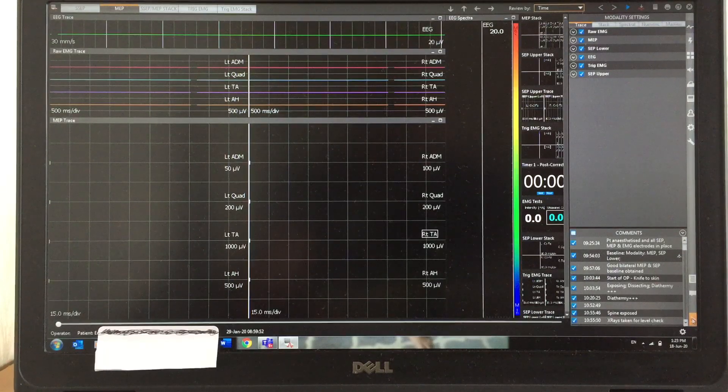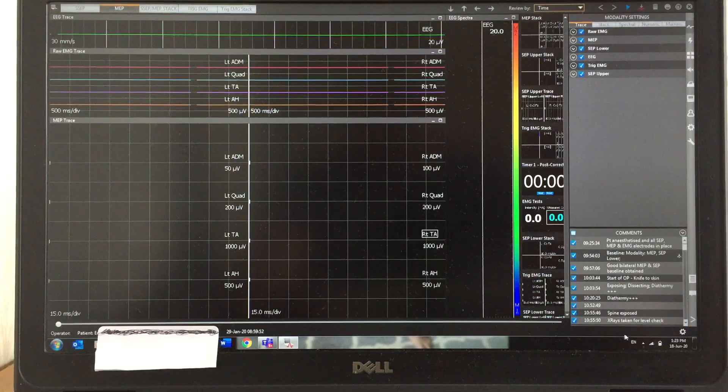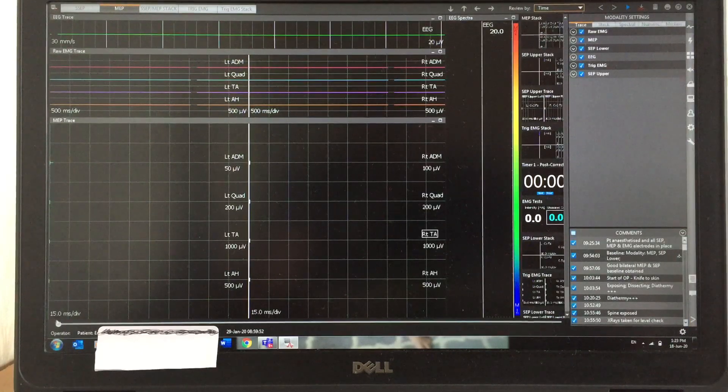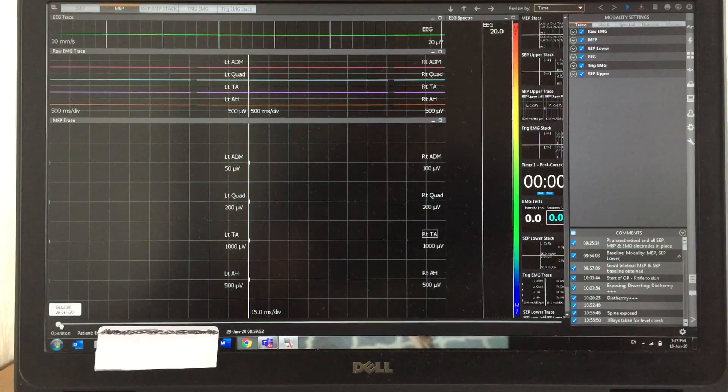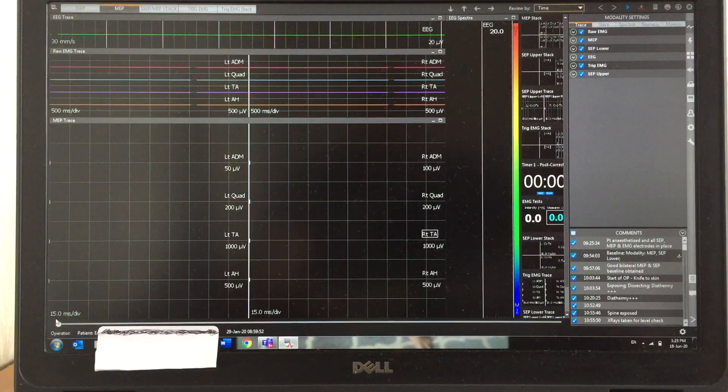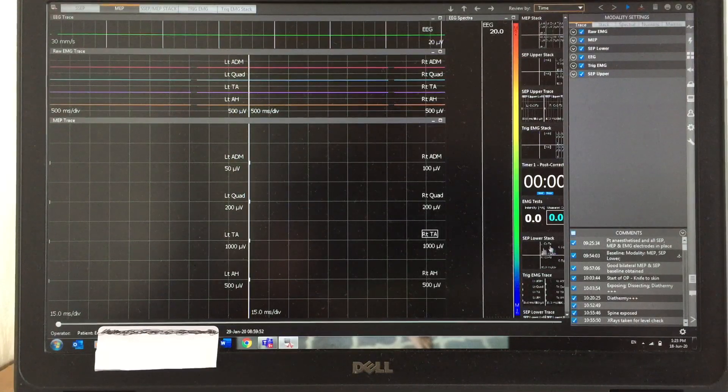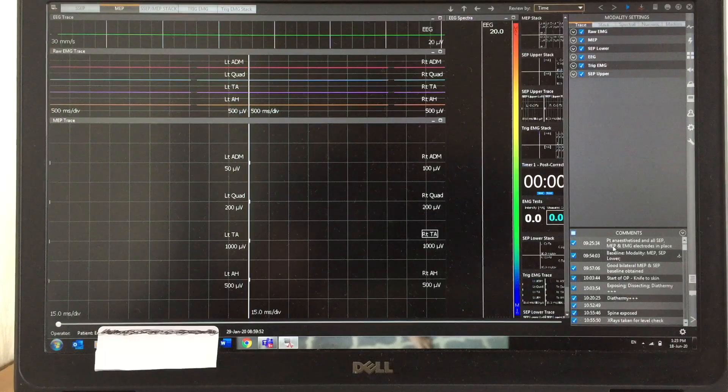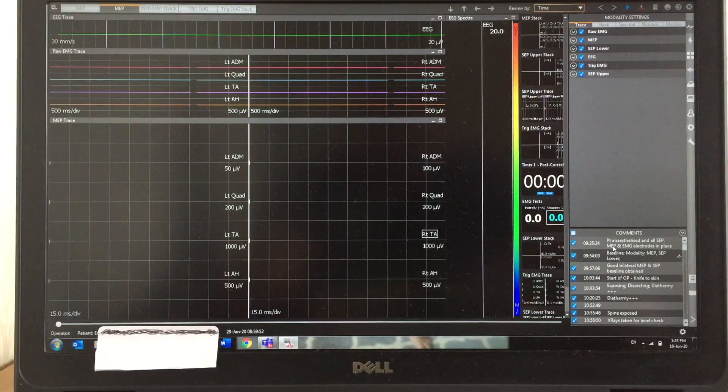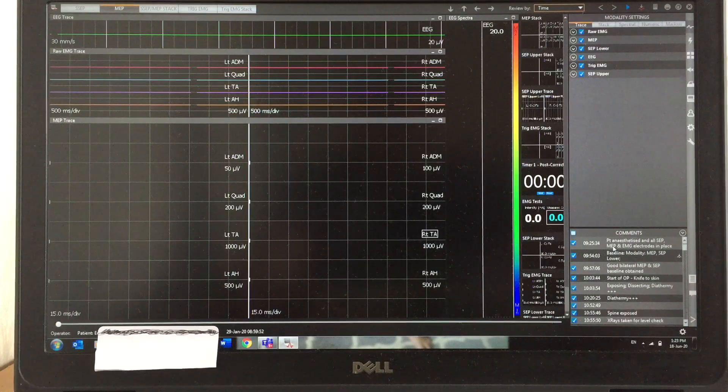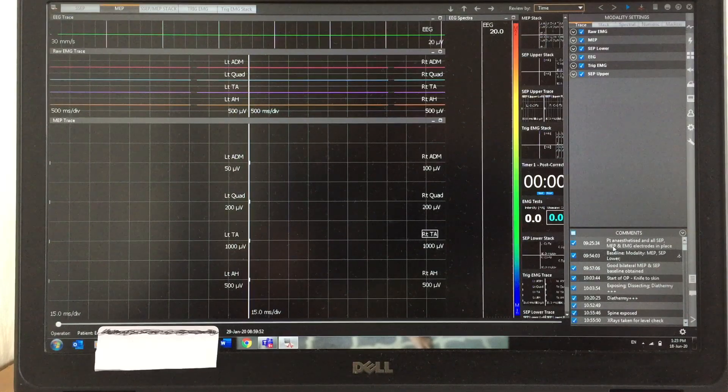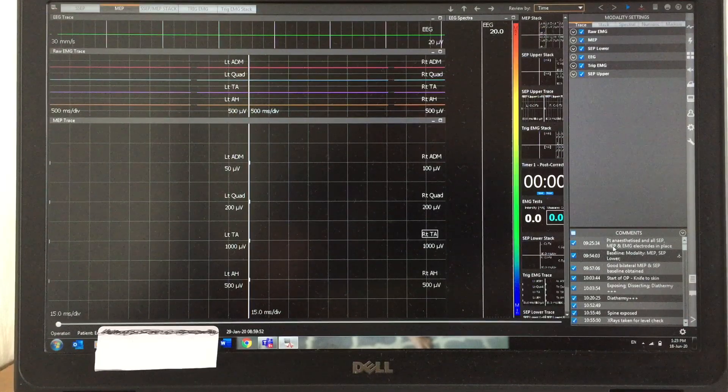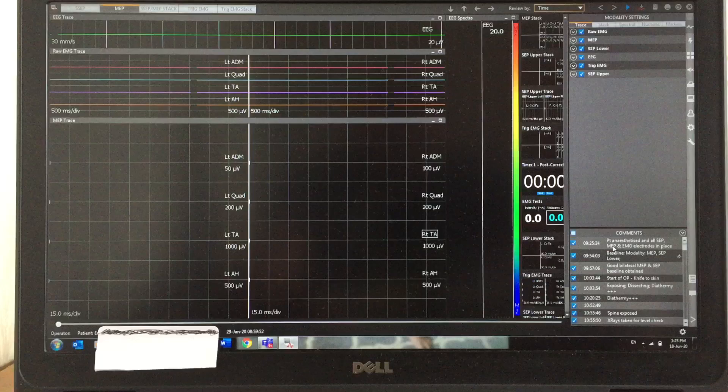Here you can see this is the starting point, the cursor. You can also see the annotation with comments: patient anesthetized and all SEP, MEP, and EMG electrodes in place.